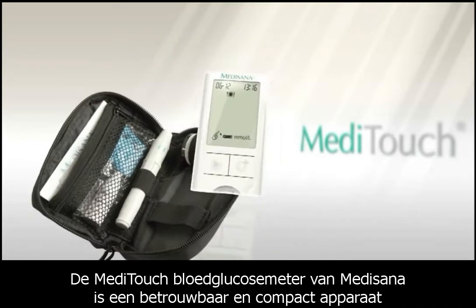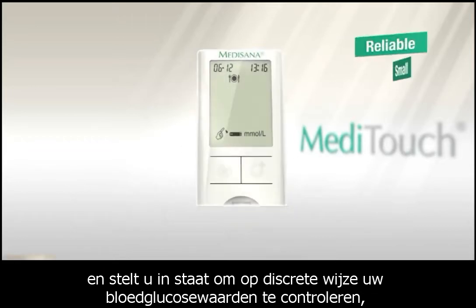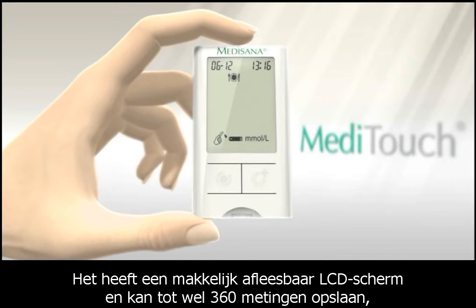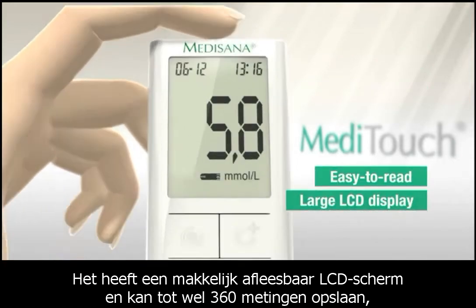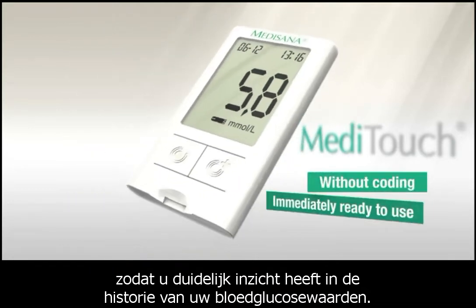The Medisana Meditouch Blood Glucose Monitor from Medisana is a reliable small device that allows you to discreetly check your sugar levels whenever and wherever you want. It also has an easy-to-read large LCD display and allows you to store up to 360 readings so you can track your blood sugar levels over time.